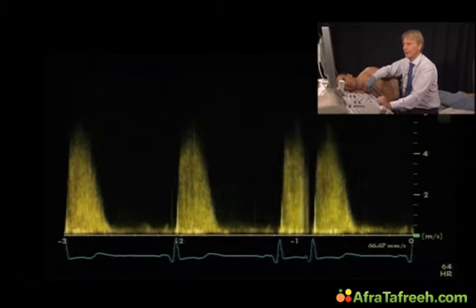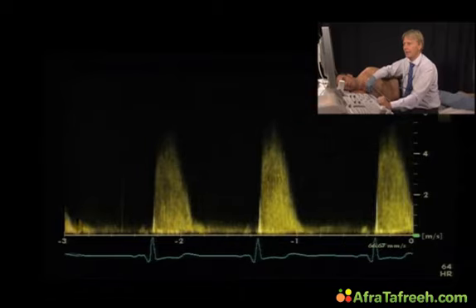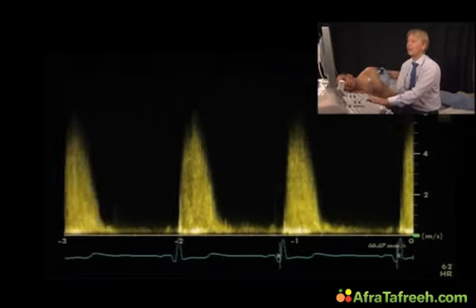And here you can see that the maximum velocity is now higher than what we had before. Here we have a signal which is almost 6 meters. So, in conclusion, very important, first to put the patient in a right position as far as possible. Second, to listen to the signal, small motions, and to try more than one transducer position.